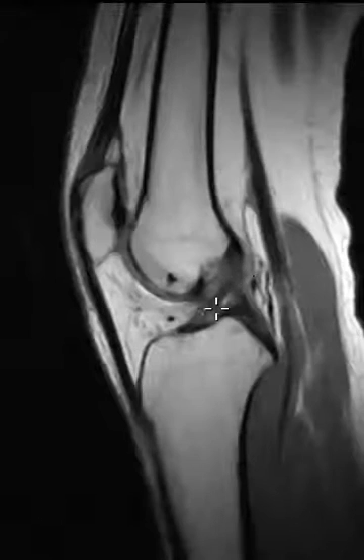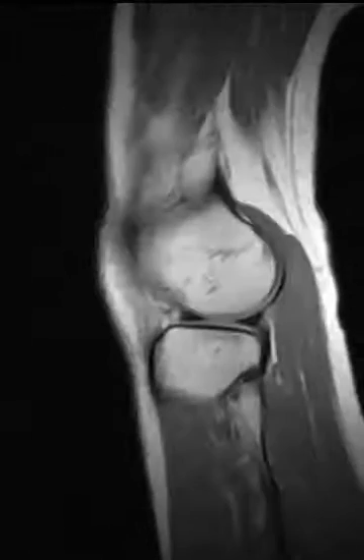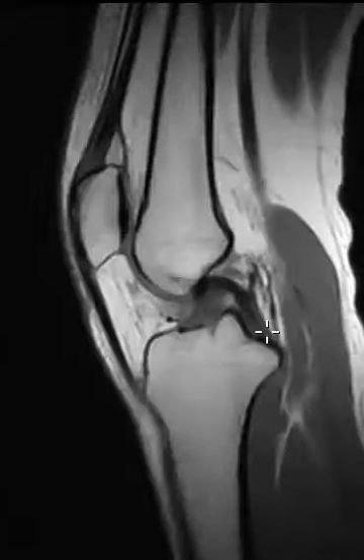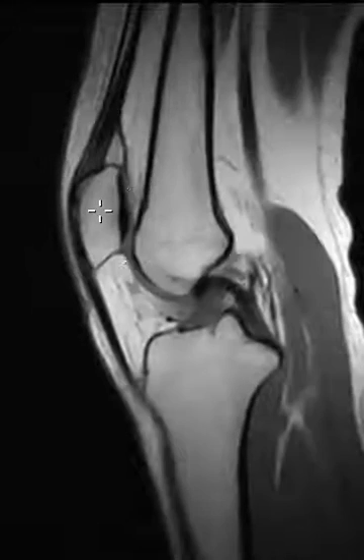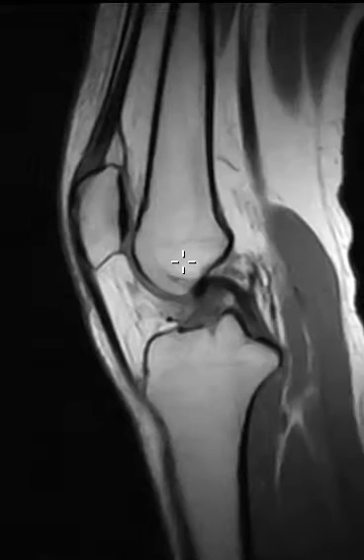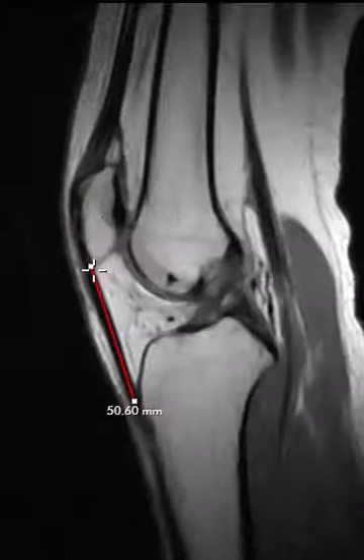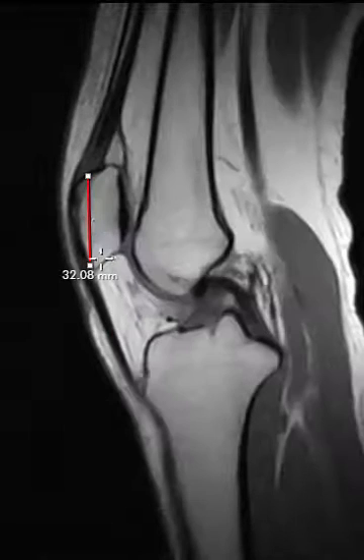If we put up a sagittal view here, things look pretty good. Again, ACL looks good, PCL looks good, lateral meniscus, medial meniscus all looking good. At first glance, the patella looks pretty good, but if we measure this here, we can see that the patellar tendon is a little bit long.